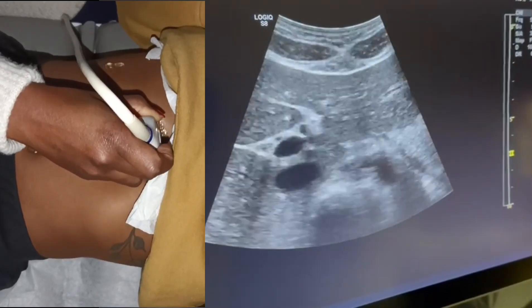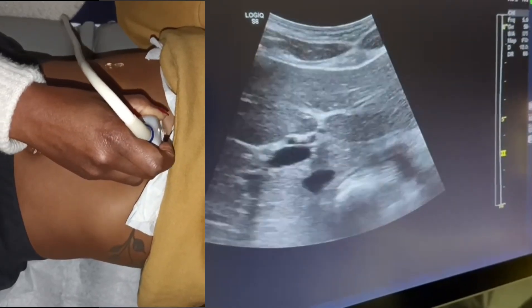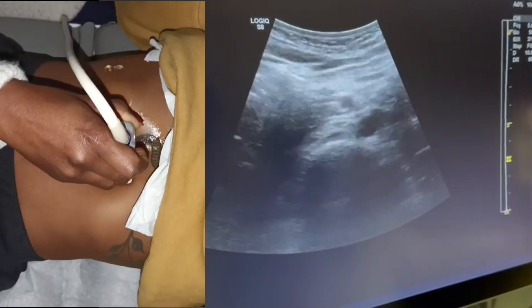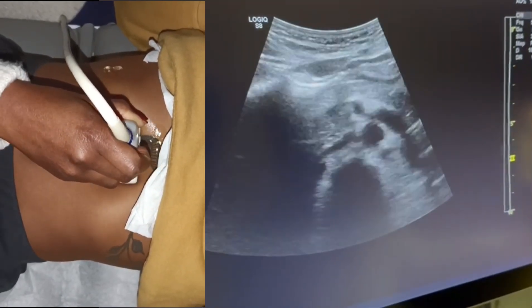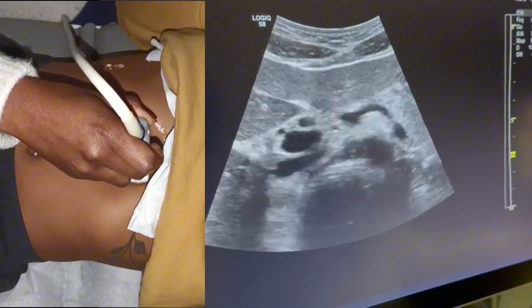Today we're looking at the portal vein, hepatic veins, and superior mesenteric veins. The goal is to perform a complete hepatoporto Doppler.